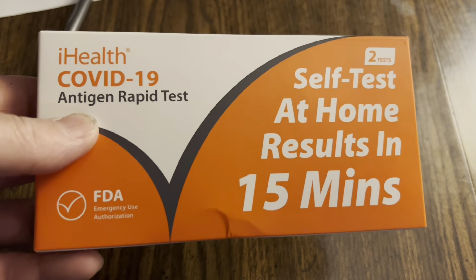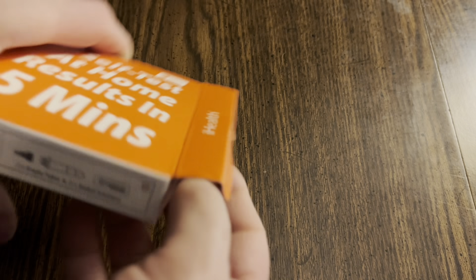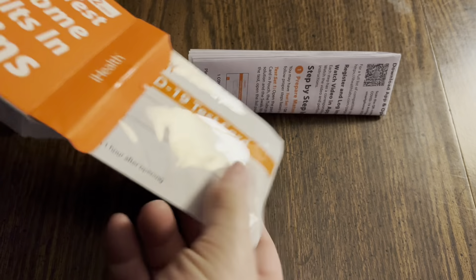Hello there, my friends. We're going to take these iHealth COVID-19 rapid antigen tests. Let me show you how to do it. Self at home results in 15 minutes — that is what we're doing today.